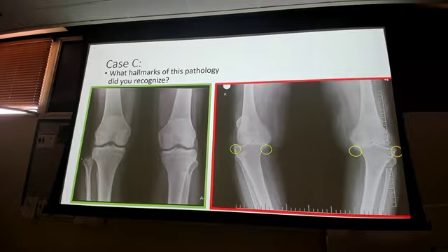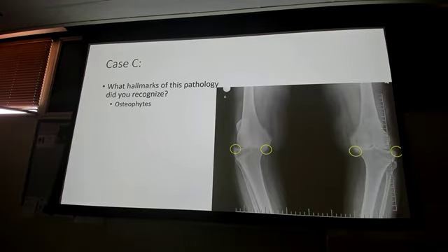What are those? Osteophytes. Remember, osteophytes are that overgrowth of bone. I had a good question: hey, you said osteophytes and bone spur as well, you see them on the arthritis, what is what? Well, they're all the same. Osteophytes is just overgrowth of bony area where it's not supposed to be. Osteophyte is a medical term.